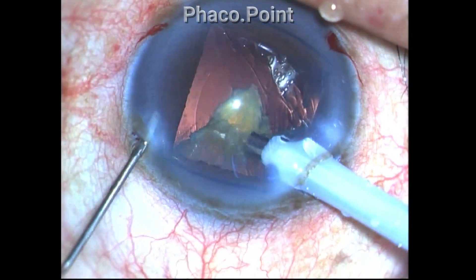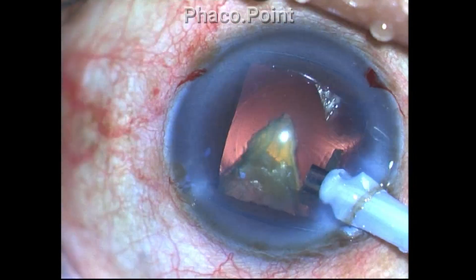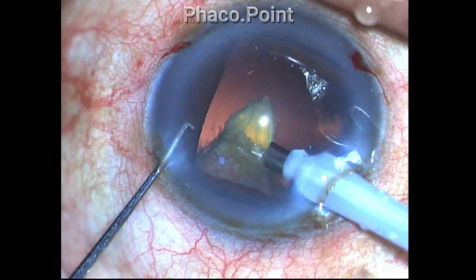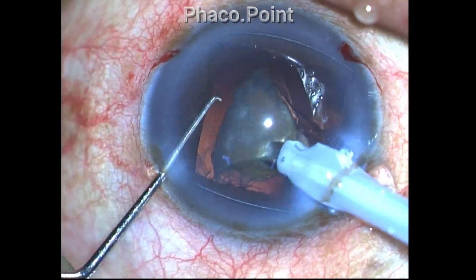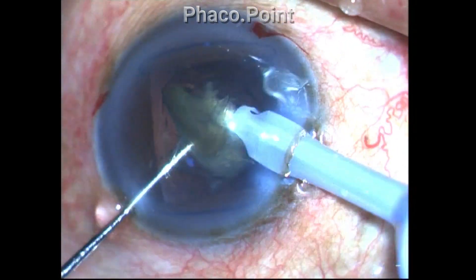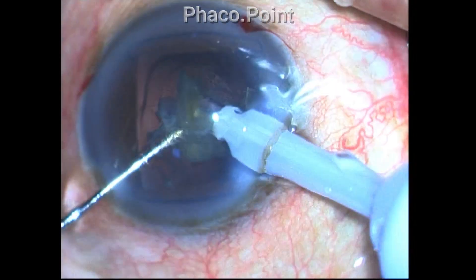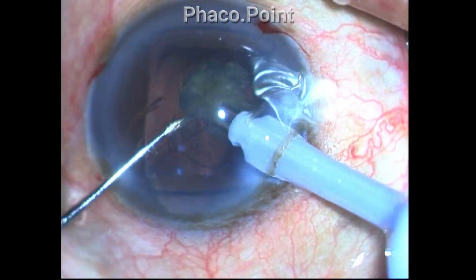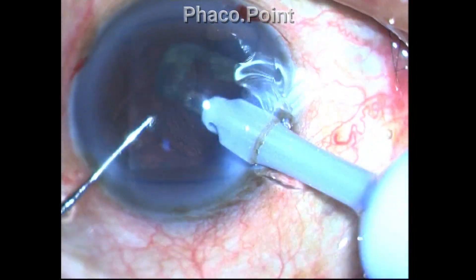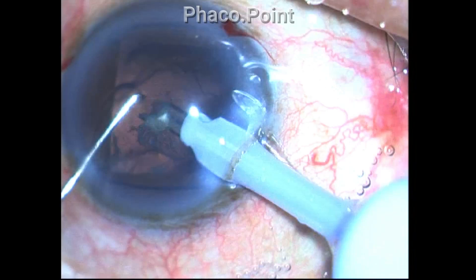I now have only the last fragment to remove and everything looks fine. The capsulorexis edge looks fine, the posterior capsule is okay, and there's just one small fragment to remove. The mistake I made probably is that I did not switch over to micropulse mode — I continued with the multiburst mode of phaco. I managed to successfully remove one piece without disruption of the posterior capsule.